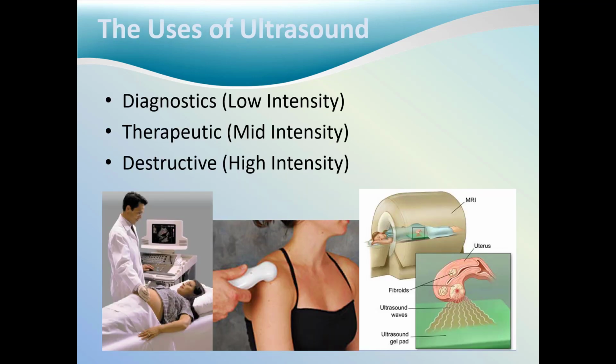The primary advantage of ultrasound over other non-acoustical heating modalities is that tissue high in collagen, as well as other deep tissues, may be selectively heated to a therapeutic range without causing significant tissue temperature increase in the skin or fat. High collagen tissues that respond well to ultrasound heat include tendons, muscles, ligaments, joint capsules, joint menisci, intermuscular interfaces, nerve roots, periosteum, and cortical bone.